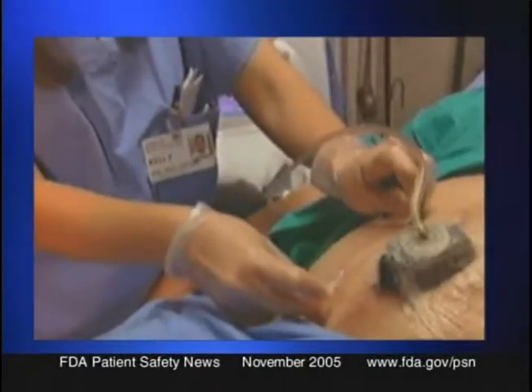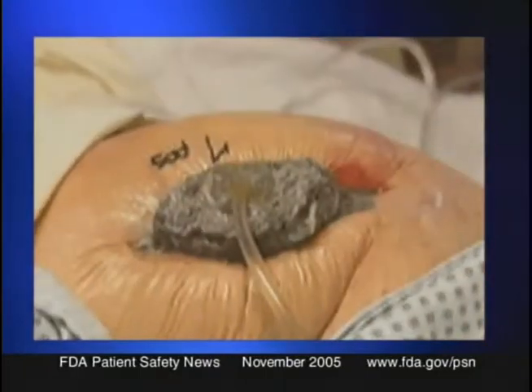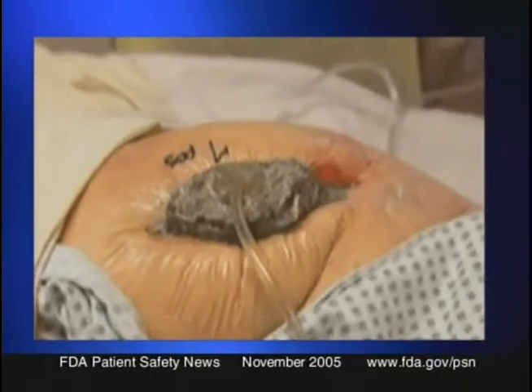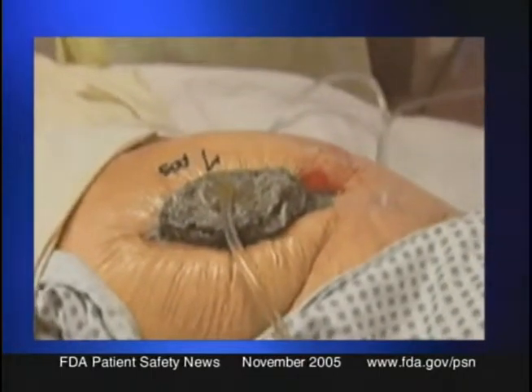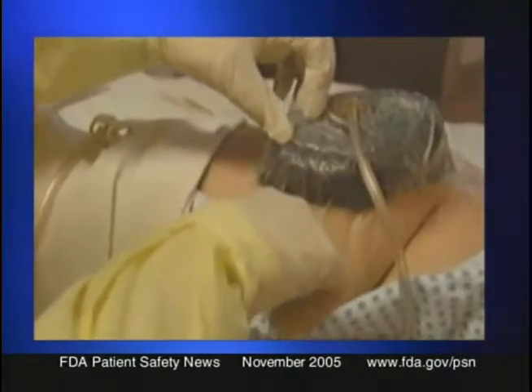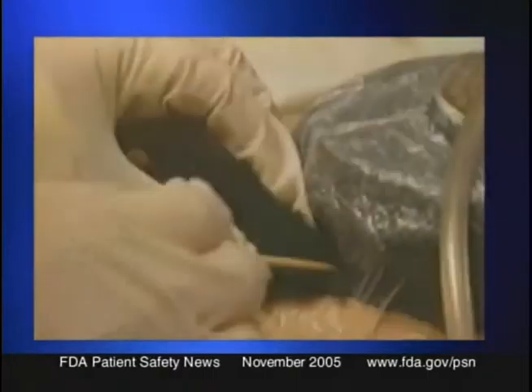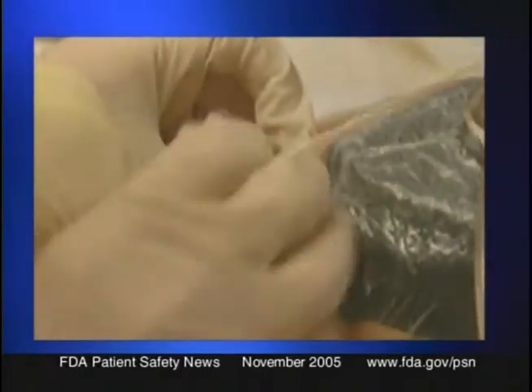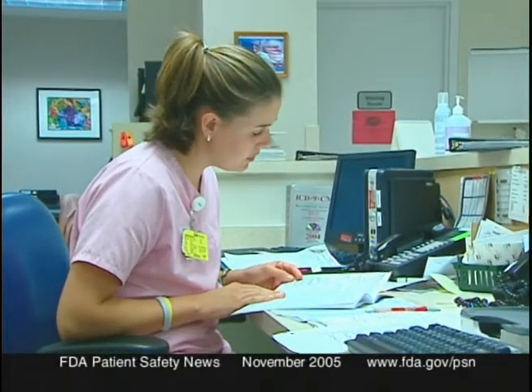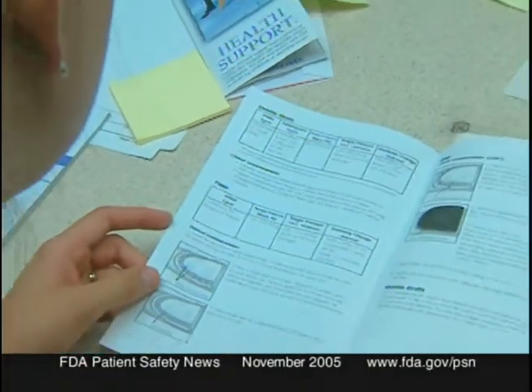For example, certain patients should be closely monitored for overt and occult bleeding. This includes those who are actively bleeding on anticoagulants or who have weakened, irradiated, or sutured blood vessels or organs that are close to the wound. Use protective barriers, such as gauze impregnated with petrolatum, to protect vulnerable blood vessels or organs. And follow the device manufacturer's instructions for use, including selecting the correct negative pressure that's recommended for that type of wound.